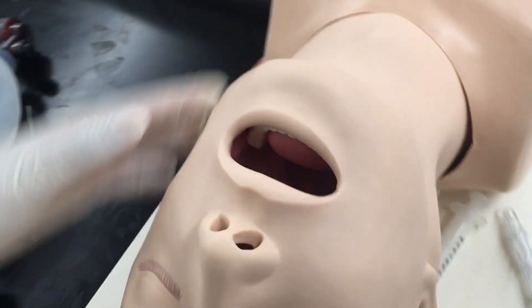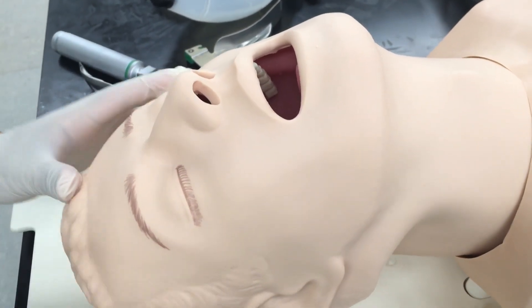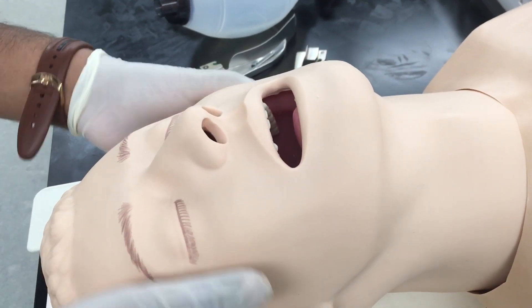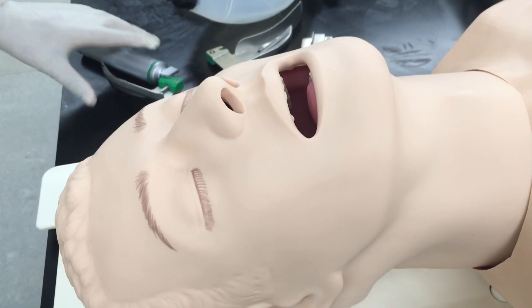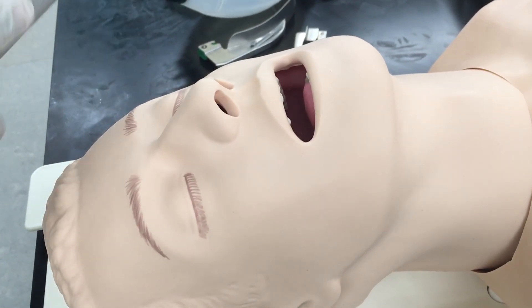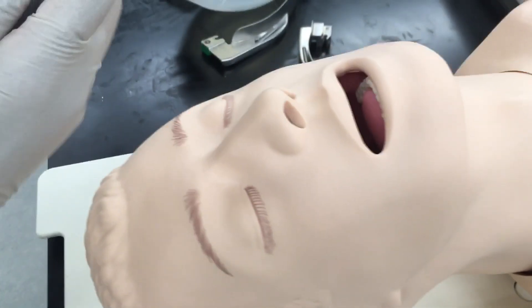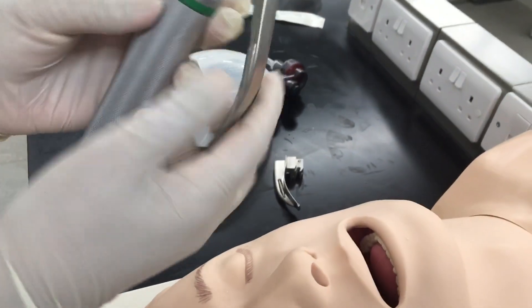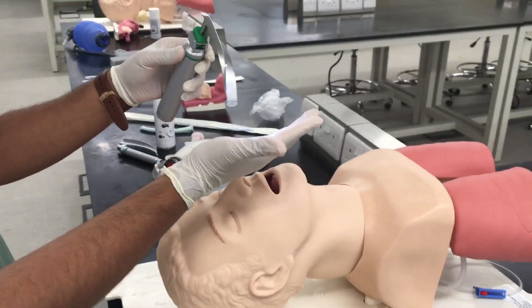After you assess the airway and the patient is predicted to be easy to intubate, make sure you have the equipment ready. This is the blade — size Mac 3, which is the adult size. Make sure it's working.